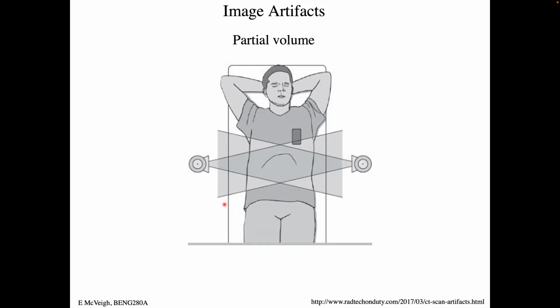So unfortunately, we have to re-bin all of these views to get sort of a parallel recon model going. But it tells you that the true volume that you can trust with this CT, the true 3D volume, is this kind of football shape right here, right? So anything up here, over here, it's probably not going to be in view. You'll have to wait until you can move the patient into this. This geometry is exaggerated a bit. Okay.